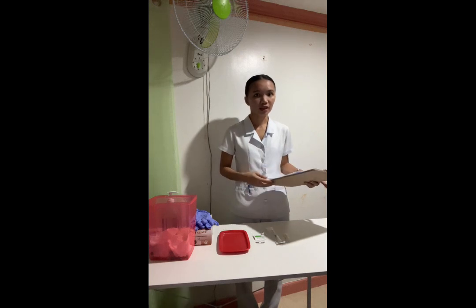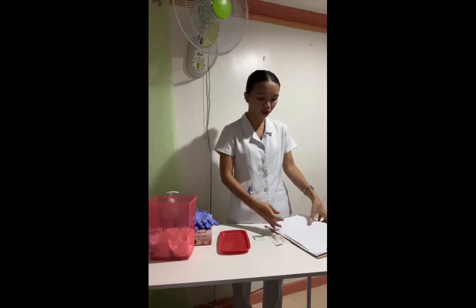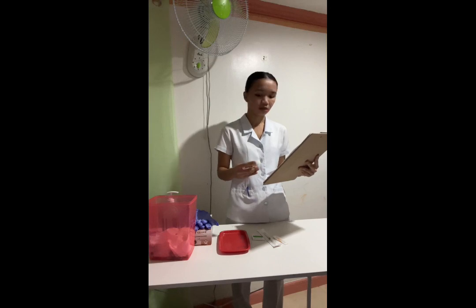So prior to going here, I had already checked the medication along with the MAR to check the label of the medications that are needed. And also now, before we withdraw the medication, I will check now the medication together with the MAR.